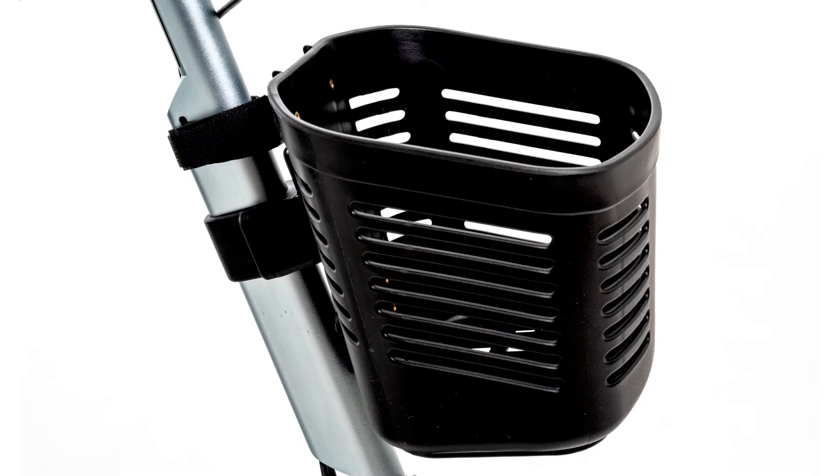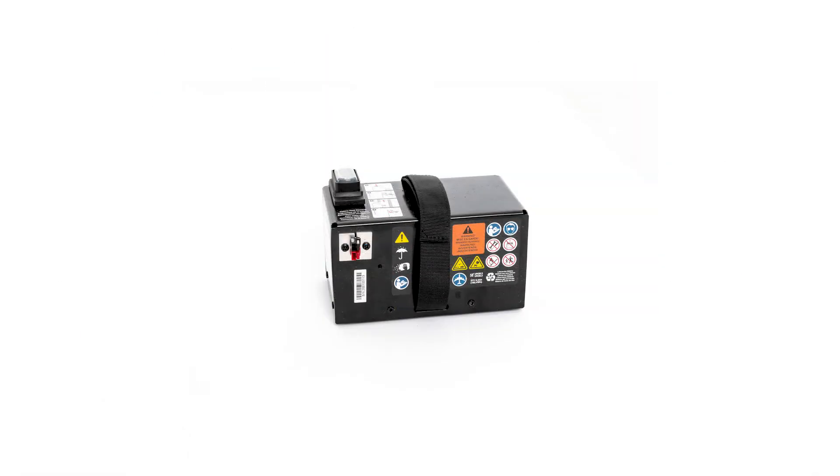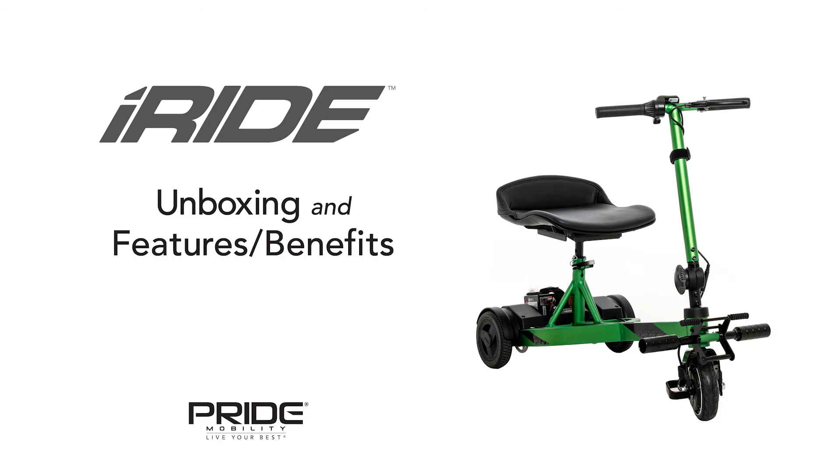The iRide comes in five anodized color options and has additional accessories available for purchase, which include a front basket, an additional battery pack, or military patches. The iRide is a great addition for someone that is on the go looking for a quick and easy mobility solution. On behalf of the team at Pride Mobility, thank you — welcome to the iRide.